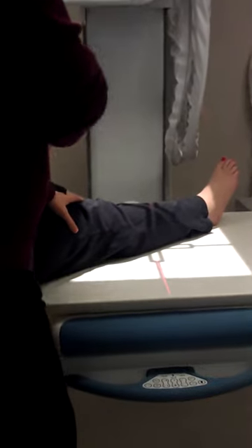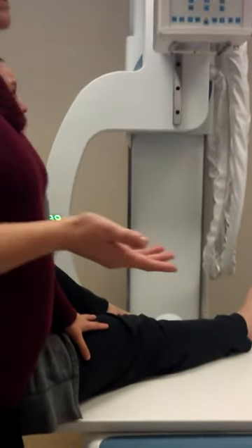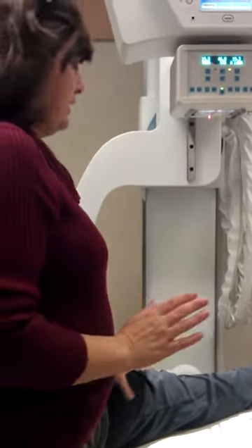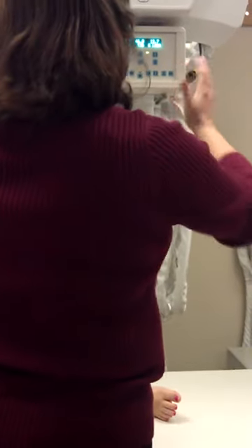A better angle, a better neutral. You're going to have to angle your patient if they don't fit lengthwise. So you'll have to open it up to 20 by 20. When you do your foot, remember it was diagonal also, so they'll fit lengthwise on an 8 by 10, but if not we can try to get them to fit. You may have to do a little maneuvering to get your patient on those diagonal.